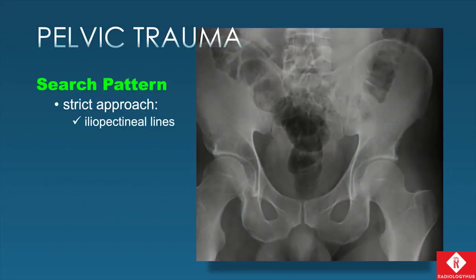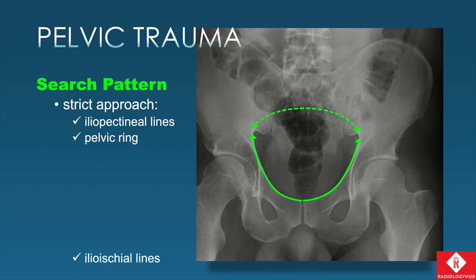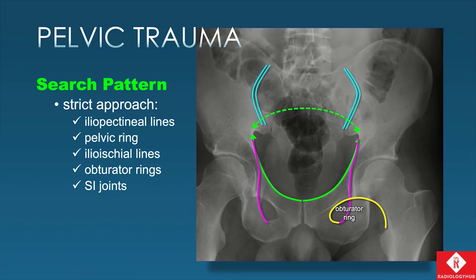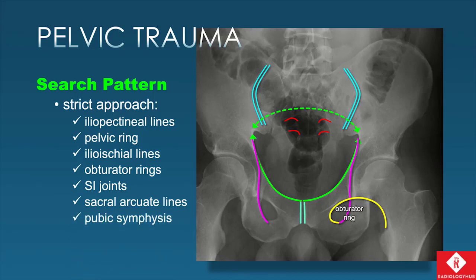The search pattern on the AP view should have a strict approach. We look at the iliopectineal lines bilaterally, follow them posteriorly to see if we have an intact ring for the bony pelvis. We follow the ilio-ischial lines into the obturator foramen and loop around the obturator ring completely into Shenton's line. We want to see smooth, uninterrupted curves. We can see the anterior SI joints more prominently than the posterior SI joints on the AP view, and try to look through the bowel gas at the sacral arcuate lines.